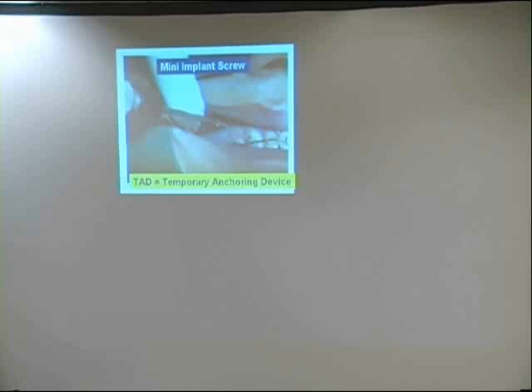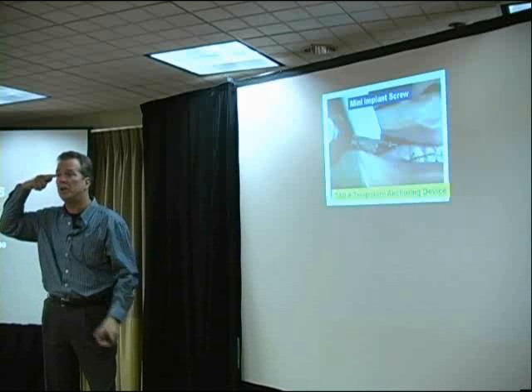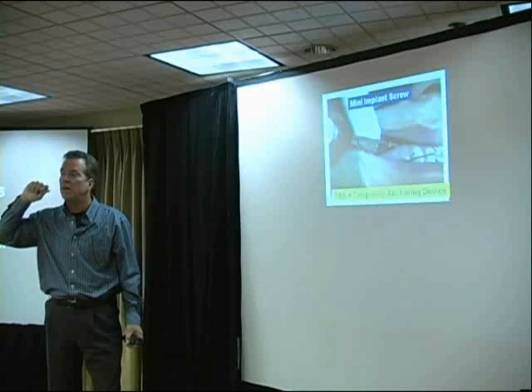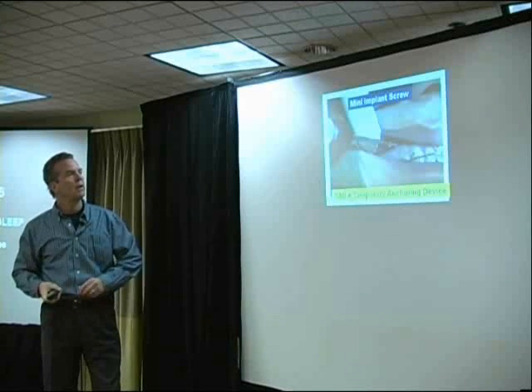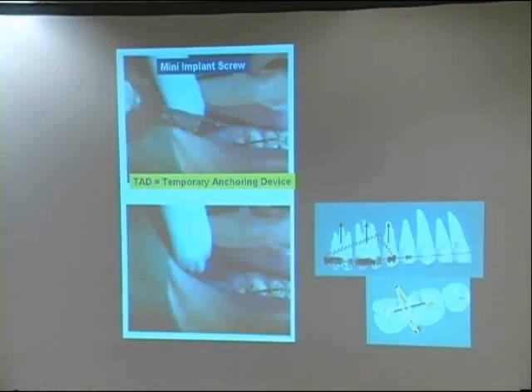Sometimes you can take the whole posterior maxillary arcade and intrude it with these new temporary anchoring devices in orthodontics. Here's this little screw here. This is just the craziest thing. With a topical anesthetic, they actually screw it into the buccal wall, the buccal plate. The patient doesn't feel it. It's like what I felt. I felt pressure. It didn't hurt. I was expecting otherwise. I'm glad I know what it feels like now. They put the screw in there, and now this anchored screw can intrude or elevate these molars.